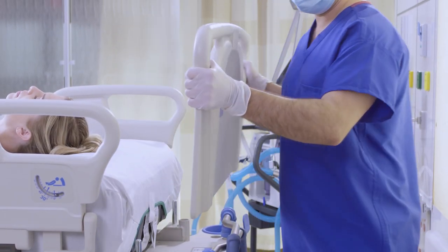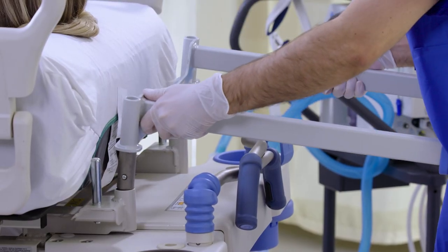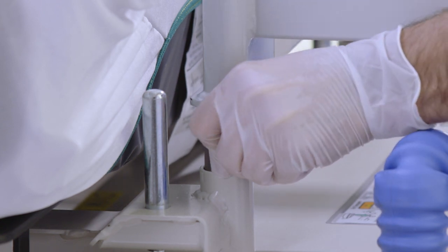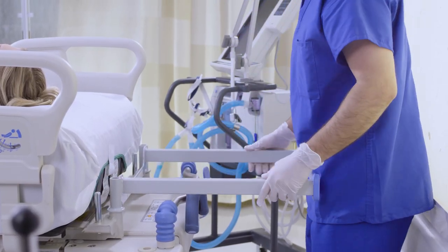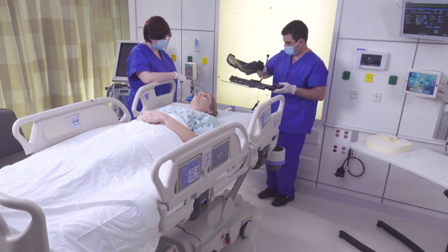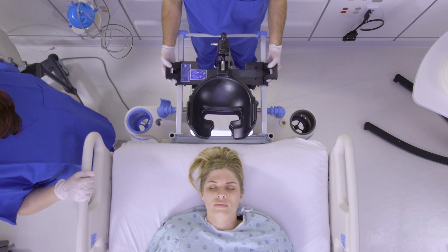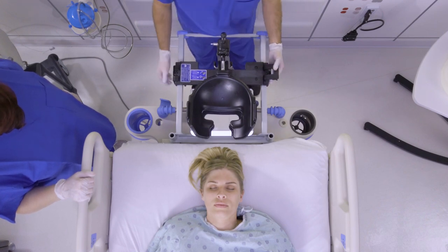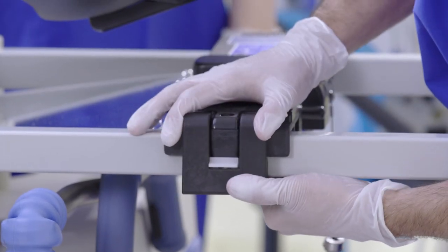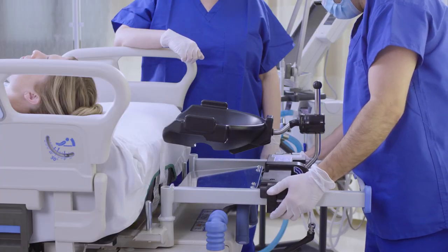Remove the headboard. To install, fully lower the posts of the head adapter bracket into the traction equipment sockets. Once secured, attach the prone head positioner onto the head adapter bracket. Firmly push down on the slide clamp latches to lock the positioner into place. Pull outward on the slide clamps to ensure that they are latched.